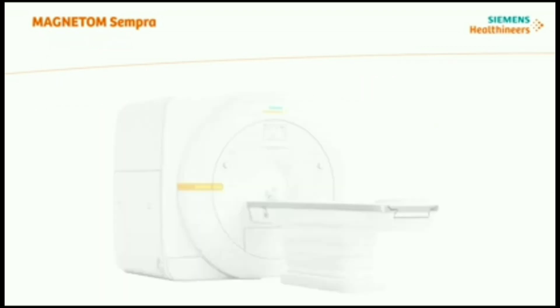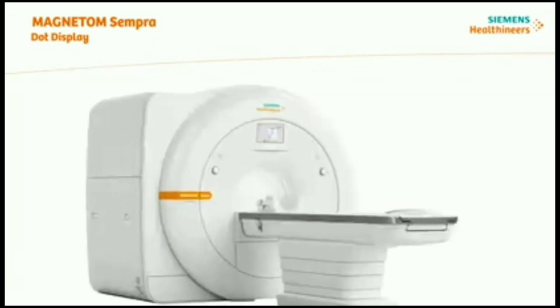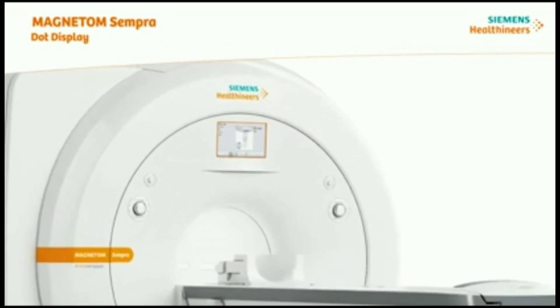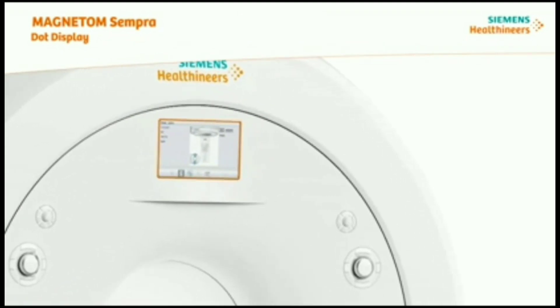Above the magnet bore opening, at the front of the magnet cover, you can find the DOT display. DOT stands for Day Optimizing Throughput. The DOT display gives you additional user guidance for fast and efficient exam preparation and start of measurement at the scanner. It also can display physiological curves and guidance for patient setup of triggering devices.